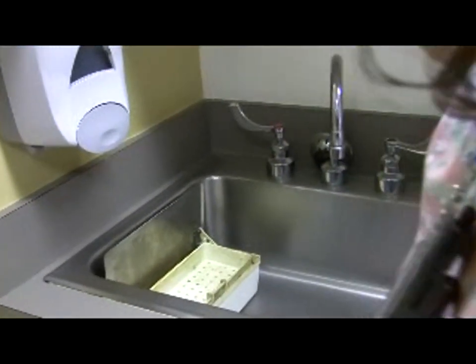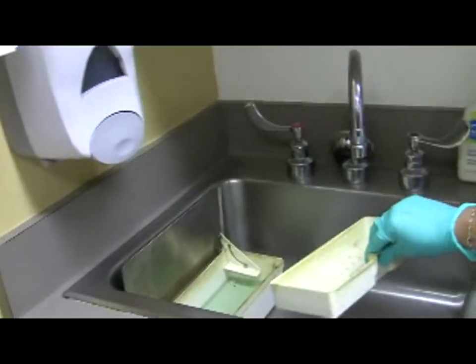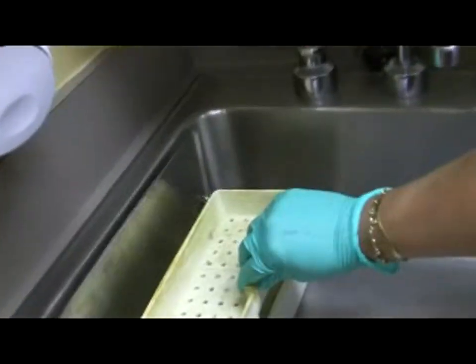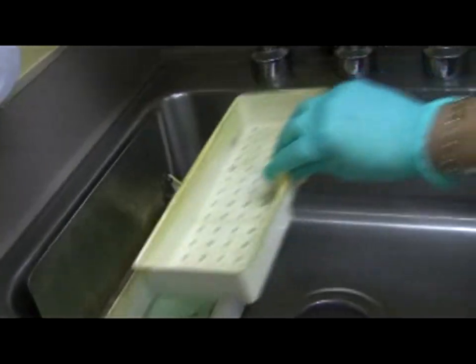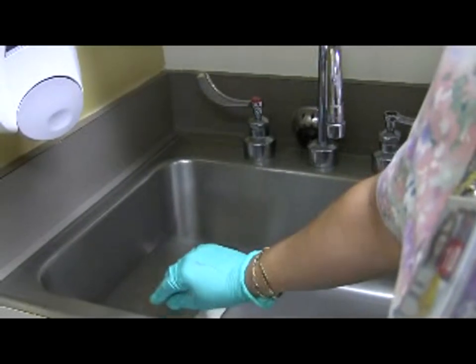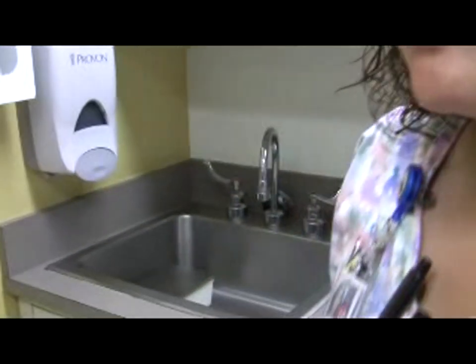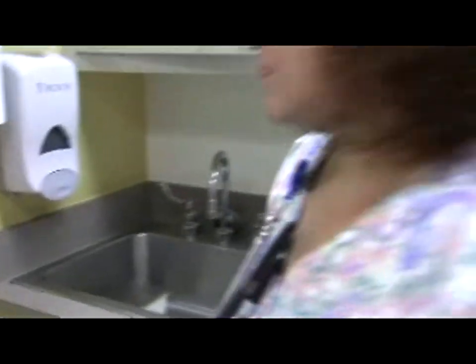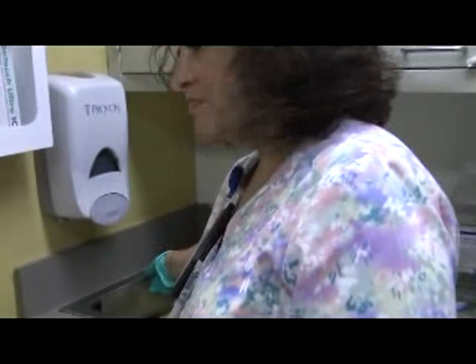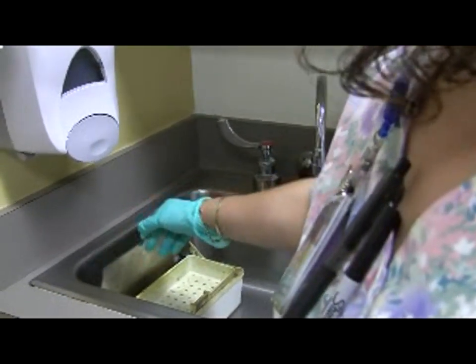Instruments with joints should be left open while soaking with SideX. You can see that if the lid is closed, the basket drops and the instruments would be covered. Otherwise, add more SideX. When the cover is open, the basket lifts out of the SideX. Instruments are lowered into the SideX when the lid closes. The bin should be a little more than half filled with SideX.